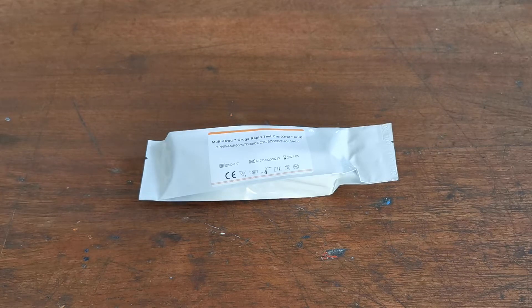Welcome to this UK Drug Testing and Valumed Medical Supply combined video demonstrating the DSD-877. This is a saliva drug test screening for six drugs plus alcohol.